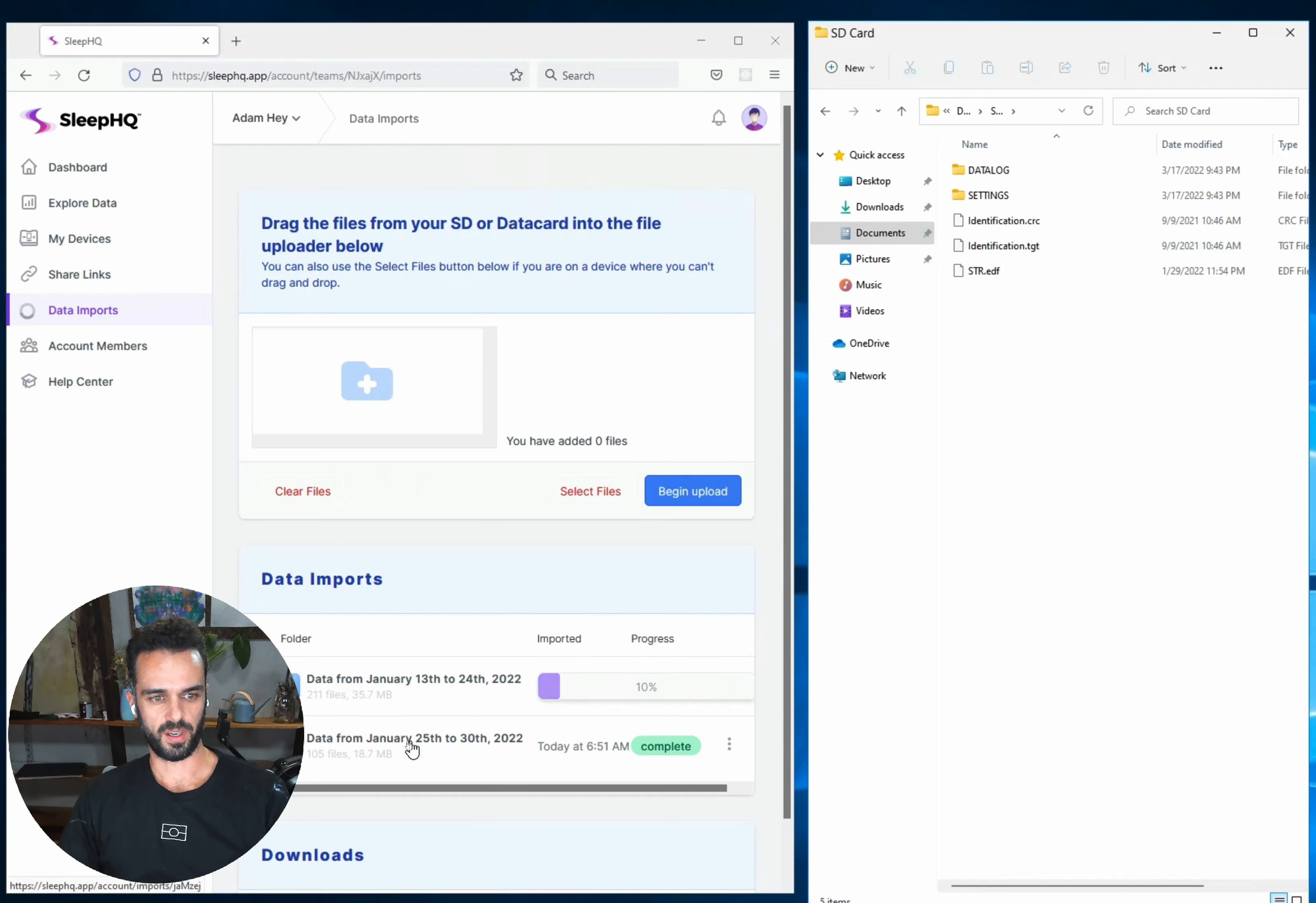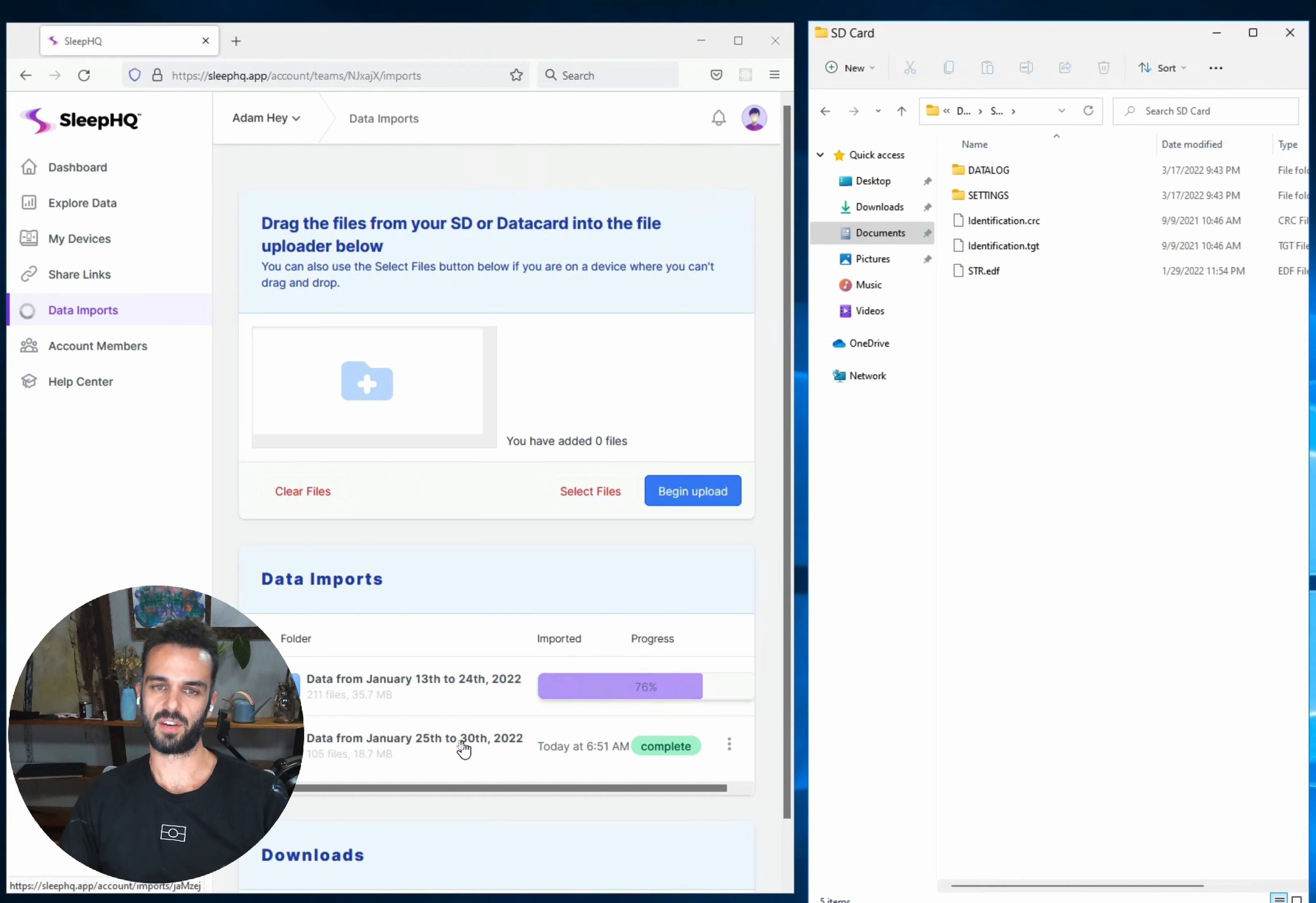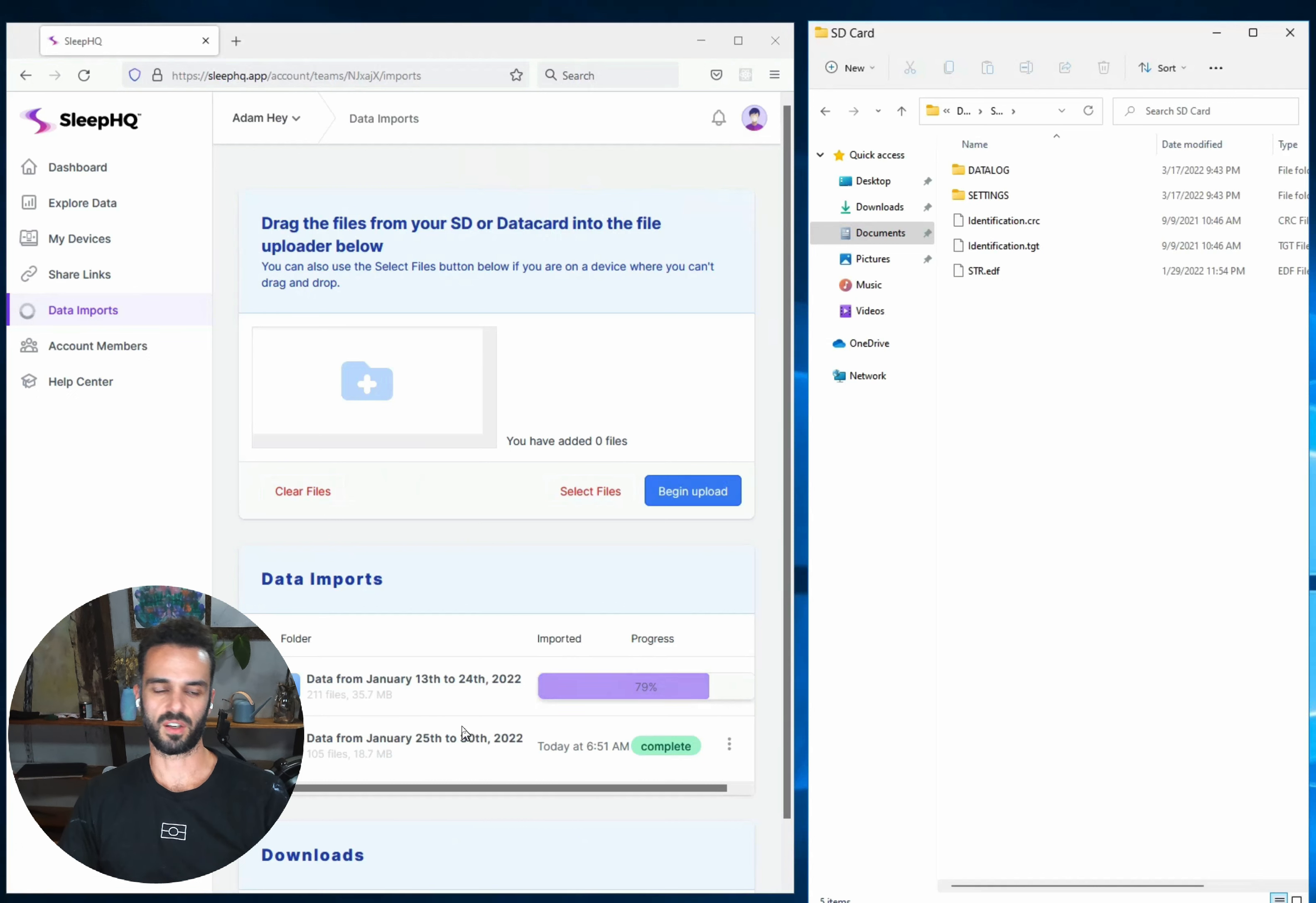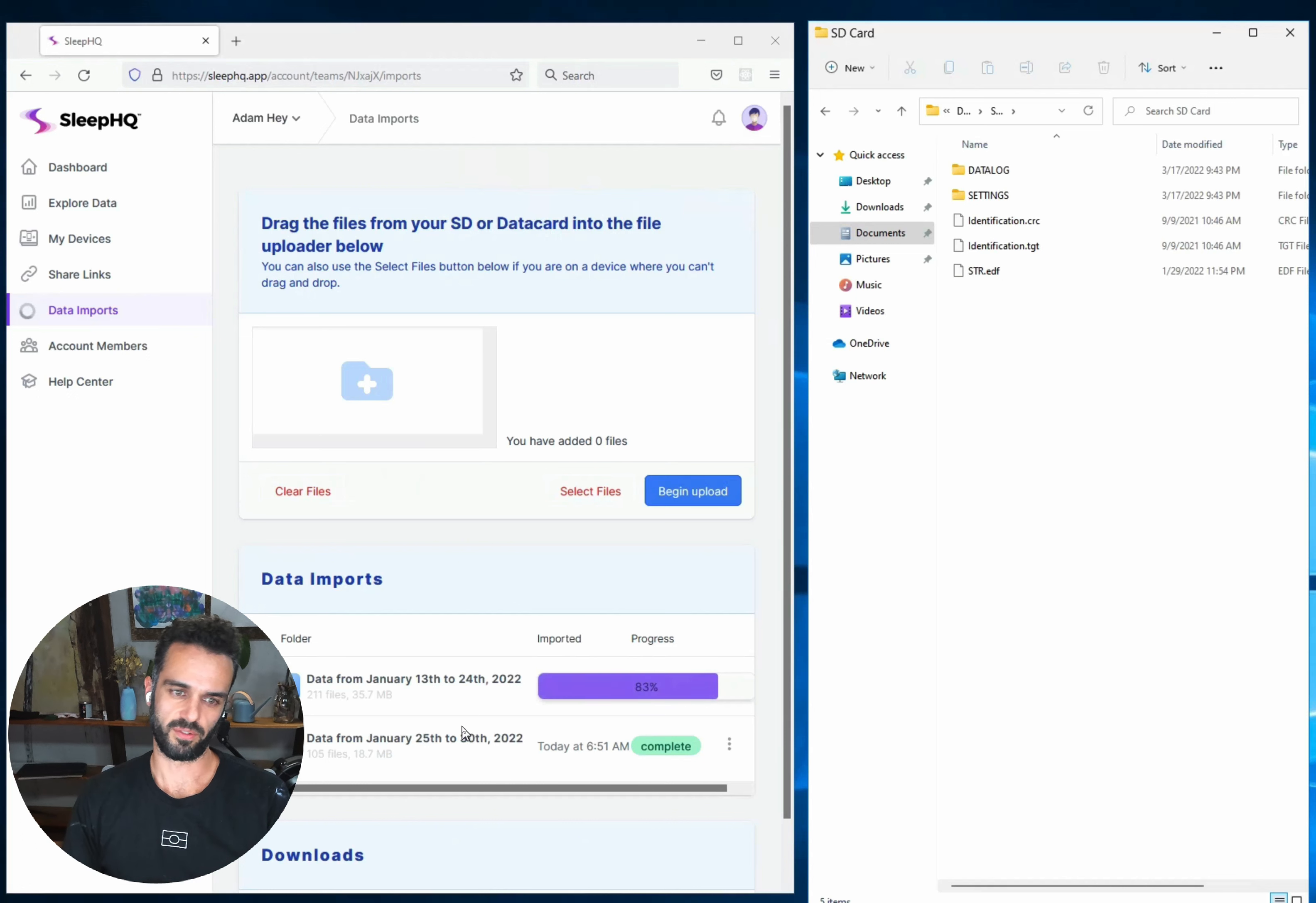Anytime when you're uploading the data, we're going to try and show you what dates the data contained. So that's going to make it easy for you. I can see now I've got the 13th to the 24th of January, 25th to the 30th of January. So the next time I do an upload, I just know I need to do everything from before the 13th of January. Now, hopefully once you've got the bulk of your data uploaded, all you're going to need to do is upload the most recent few days. So it's going to be a really quick process for you.